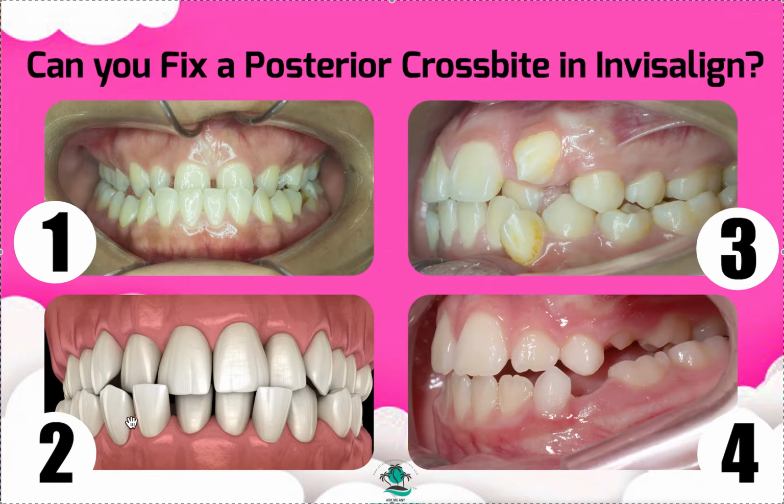And again, you're lining the teeth up in an unfavorable way. So again, this is a gamble. There's a small risk. You have to let the patient know, but at least it's looking better in this zone. And I'll leave the molars and crossbite.